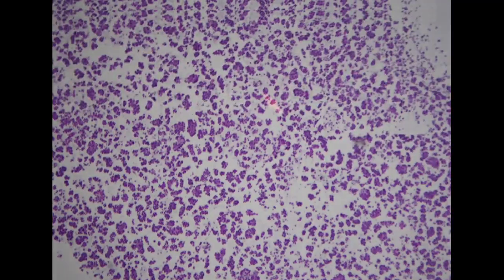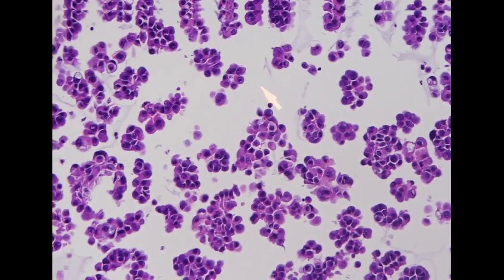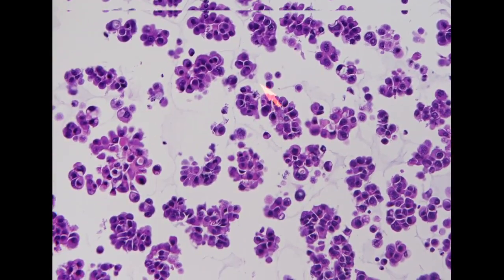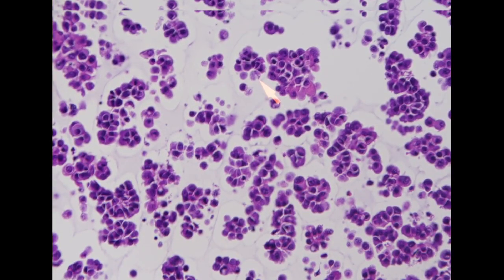And for the cell block preparation, we see tons of tumor cells. A lot of them are showing this micropapillary architecture. This is one of the most aggressive architectural patterns that we can see in lung adenocarcinoma. So, multiple micropapillary configurations. We can use this specimen to do molecular testing.